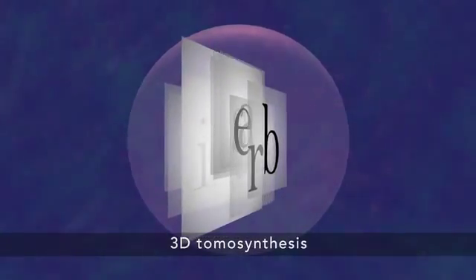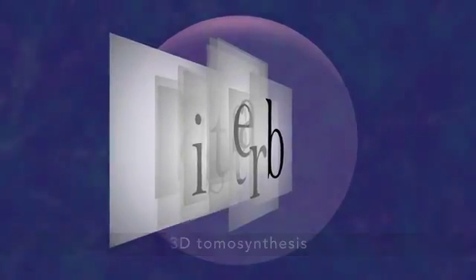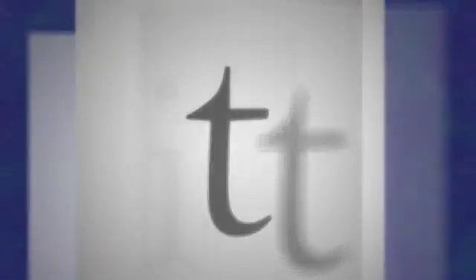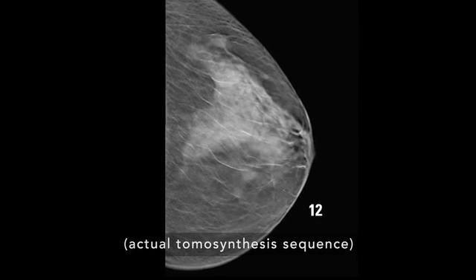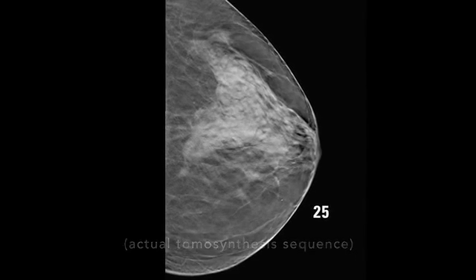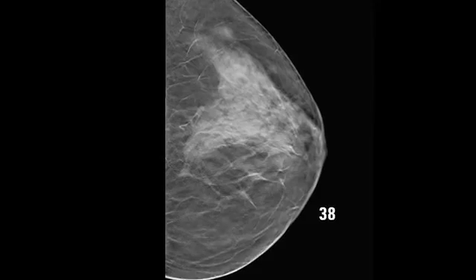3D tomosynthesis is different because it shows your tissue in very thin layers, almost like turning pages in a book. That makes it easier for doctors to see if there's anything to be concerned about. There's less chance for a cancer to hide behind overlapping tissue.